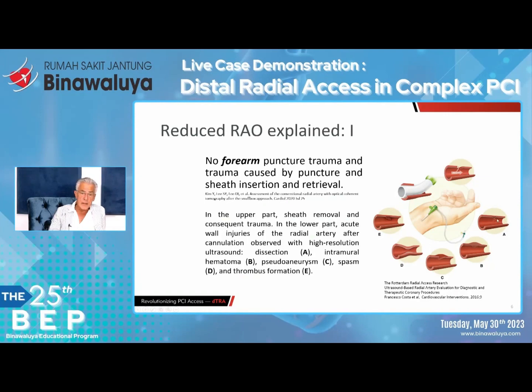There can be, due to puncture trauma, dissections can develop, intramural hematoma, pseudoaneurysms, spasm, and thrombus formation. All these actions here by us can result in early and late radial artery occlusion.